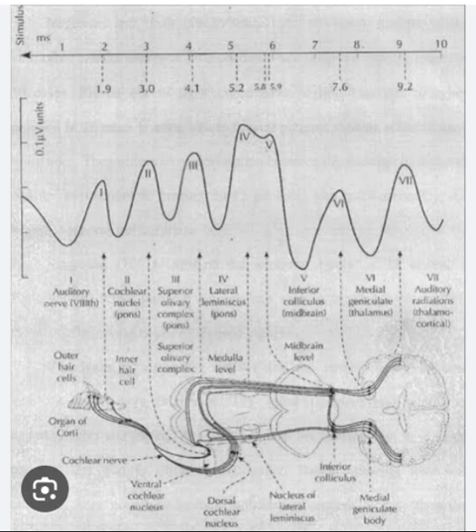Speech stimuli. In some cases, speech stimuli may be used in BERA testing, particularly when evaluating the higher-level processing of the auditory system, such as cortical responses. Speech stimuli evoke more complex and varied waveforms compared to simple click or tone burst stimuli. The waveforms can exhibit additional components reflecting higher-level neural processing related to speech perception. Speech stimuli involve more elaborate neural processing, resulting in longer latencies compared to simple stimuli.